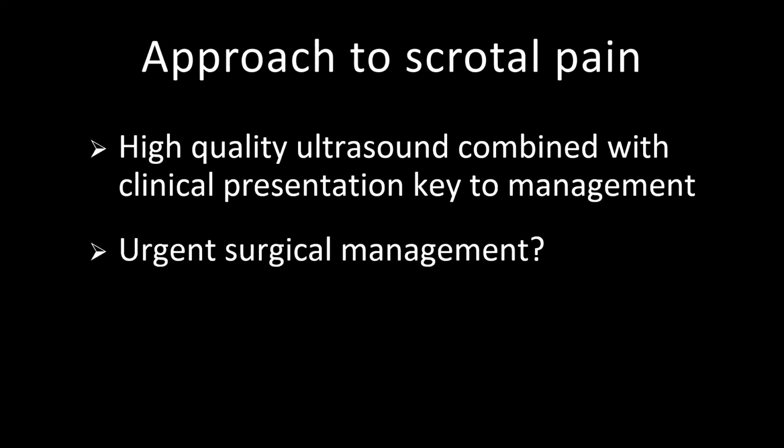So that's my first question. Is urgent surgical management needed? Is this torsion? Is it necrotizing fasciitis? Is there trauma with disruption of the tunica?